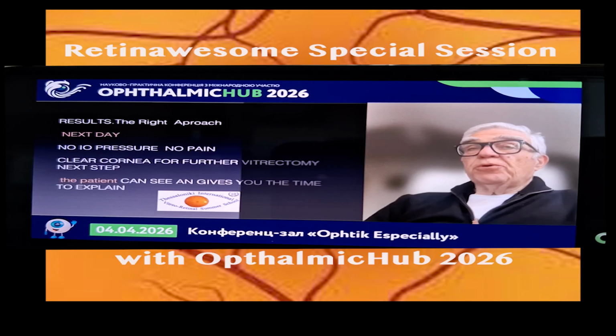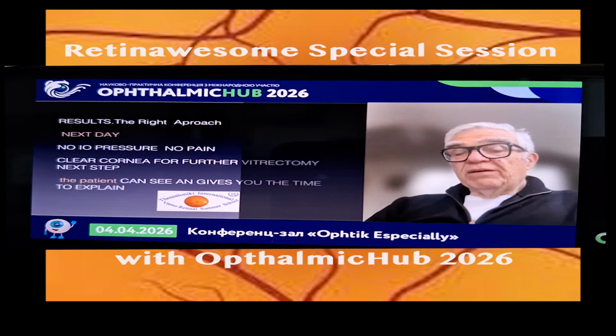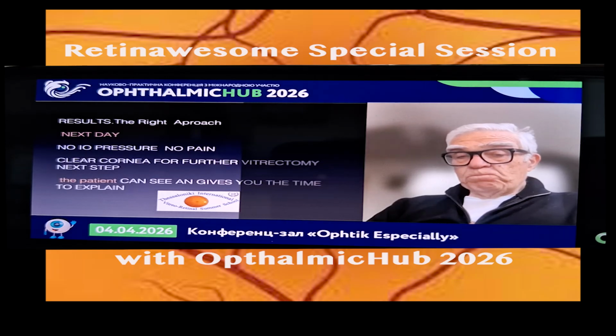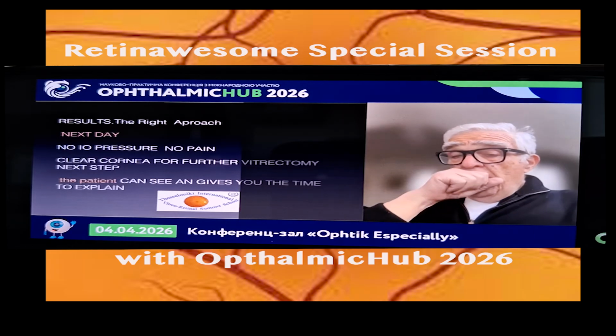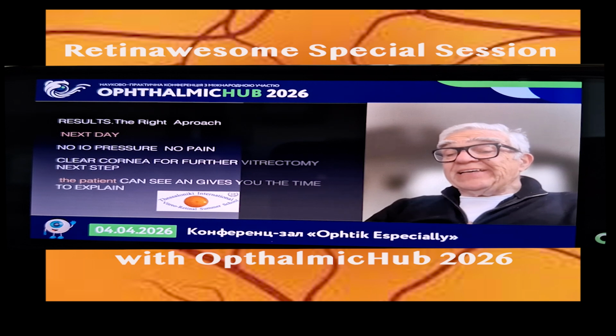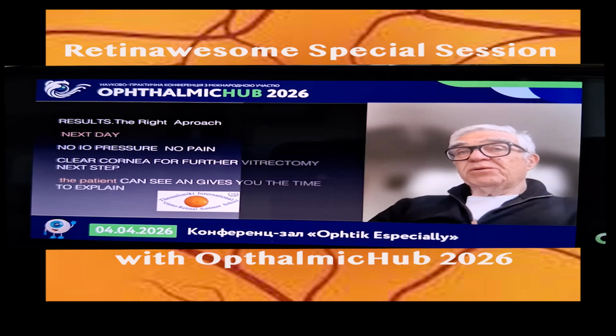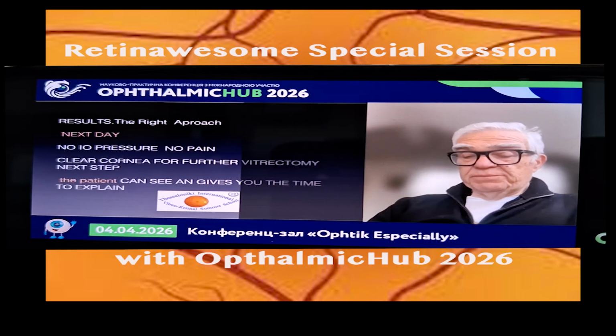If you do this approach that I am suggesting, the next day you are going to have no intraocular pressure. That means no severe pain. You're going to have a clear cornea for further vitrectomy as the next step. And the patient can see and give you the time to explain what happened. Oh, that's essential, so the patient does not feel that you blinded him.